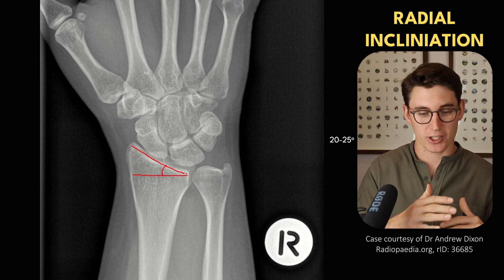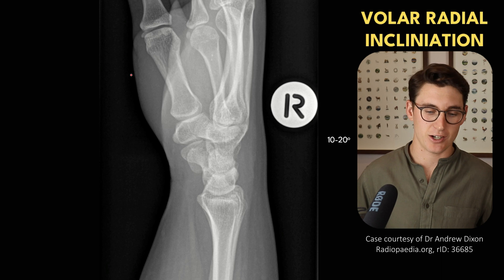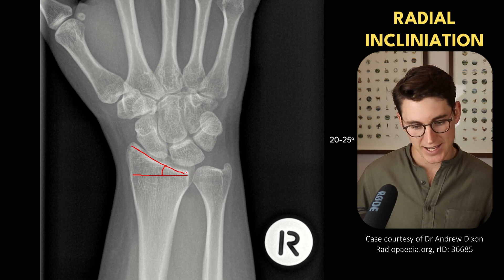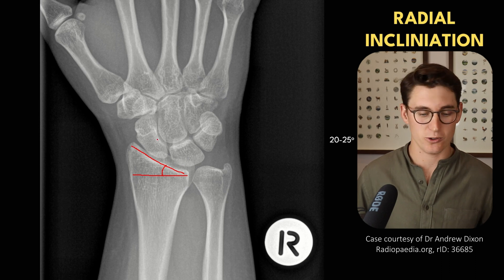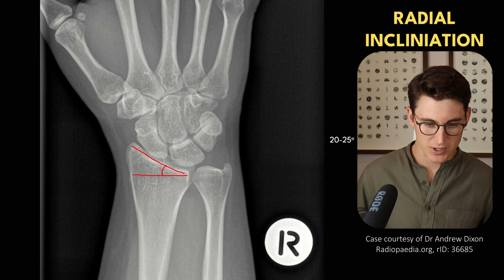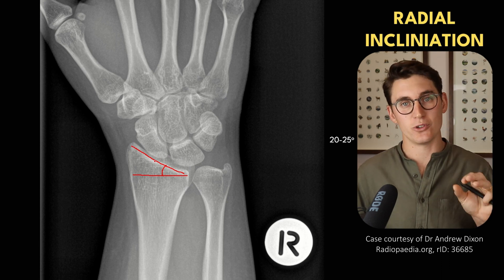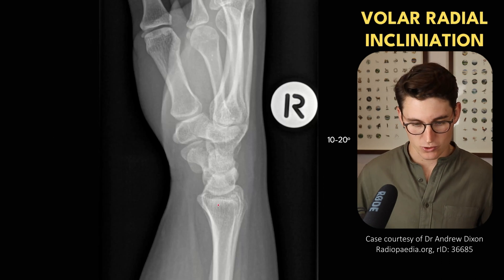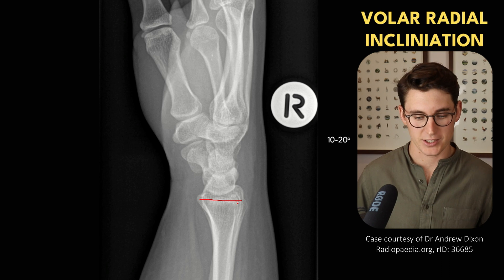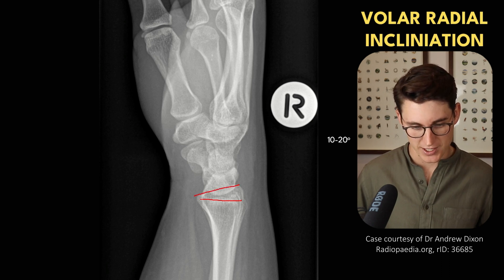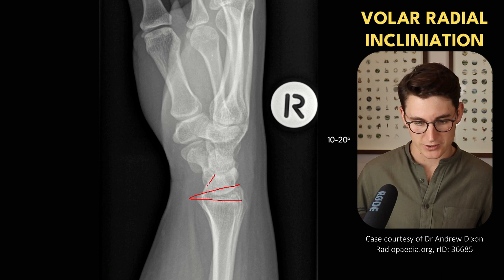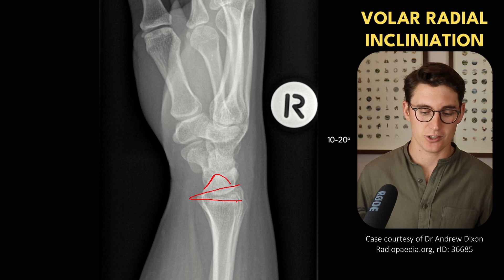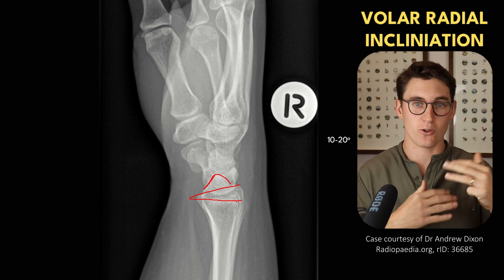Now we've looked at radial inclination on an AP view, we can also look at volar radial inclination on the lateral view. The scalloping of the end of the radius creates the articular surface for the lunate and scaphoid, and then we have the radial styloid heading upwards. When measuring volar inclination on the lateral view, we draw a line perpendicular to the shaft of the radius and measure the angle of the articular surface — not following the radial styloid. We want that angle to be between 10 and 20 degrees. Any disruption to that angle requires us to look for pathology.